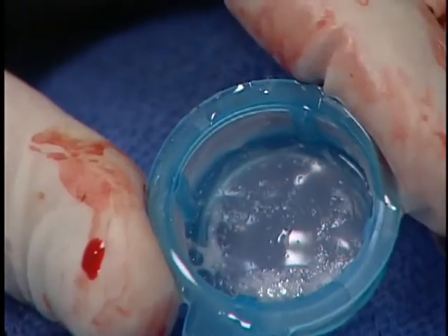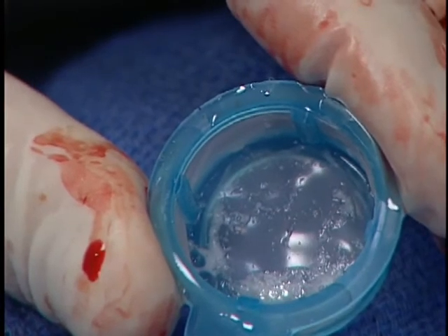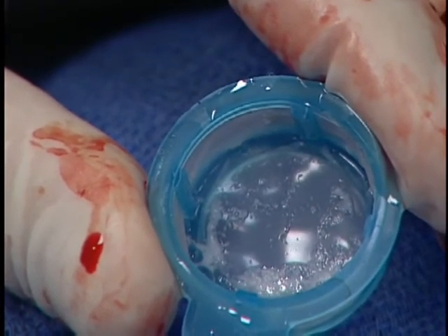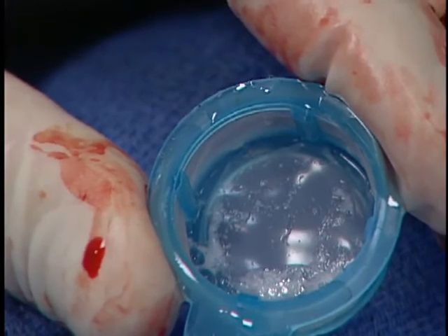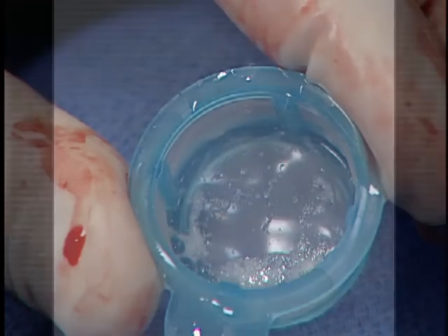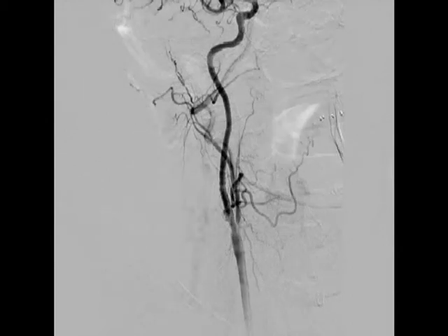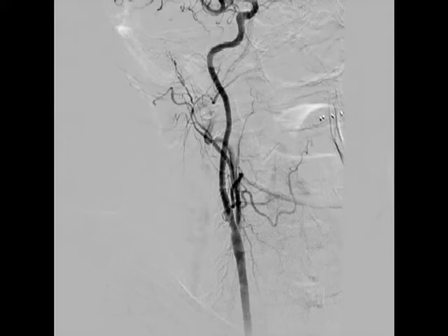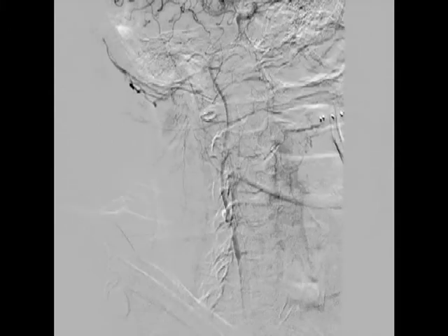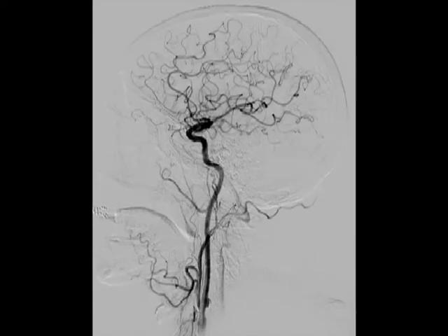We'll go ahead and filter out the blood in that chamber to see if there's anything in there. This is debris that is liberated during the stenting procedure — a lot of this is pieces of cholesterol or other products in the artery: grunge, some clots, some fibrin stranding, platelets, things like that. You can see that the stent looks fully expanded. There's a small ulcer crater trapped behind the stent — that will fill in. That could have certainly been a source of embolization for him, but otherwise it looks great.